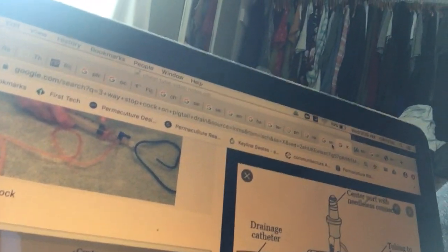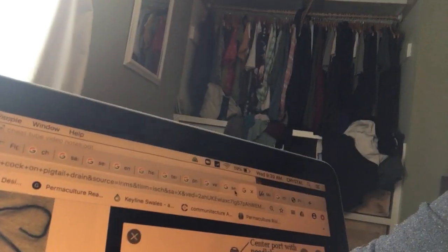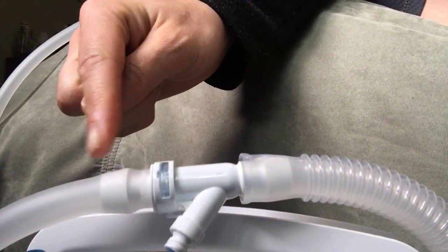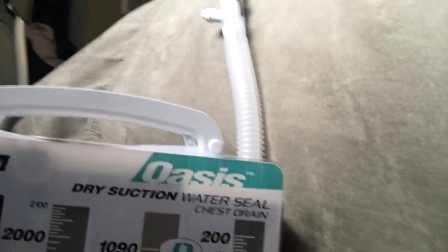There's also sometimes a stopcock somewhere else on the tube. I think our Oasis ones don't usually have them, but sometimes there'll be a stopcock here on the chest tube. There'll be a thing that you can turn, and you want it to be turned in line with the tubing so that everything can flow through. You don't want anything turned out that way or that way. You want everything in line with the tubing. And one way to see is if you have any drainage in your tubing in a dependent loop, you just lift your tubing up like this and let it drain down into your canister. And as it's doing that, you can see that the tubing can drain from this part down into this part. So those are very important things to check and assess on your tubing while you're looking at it.